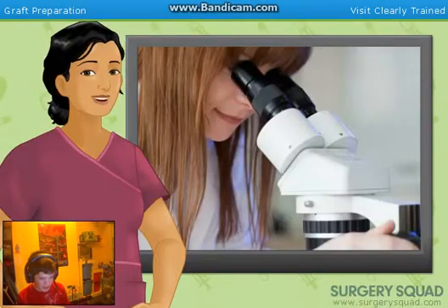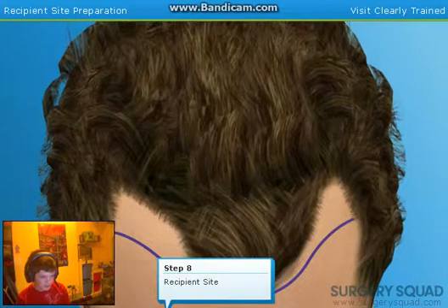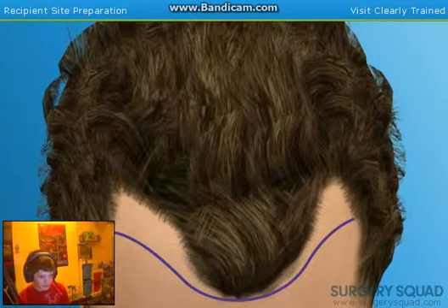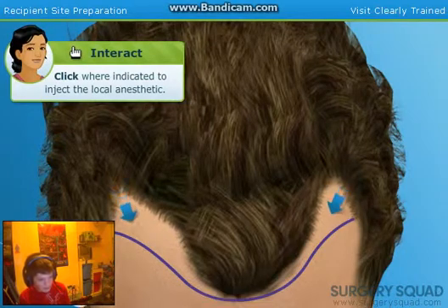Nice job! This step is repeated thousands of times to get each follicle prepared. I'll have my assistants finish up. To prepare the recipient site, you'll need to first inject a local anesthetic into the scalp. We don't want our patient to be uncomfortable.